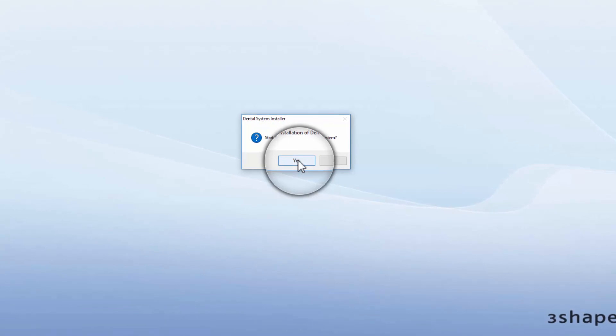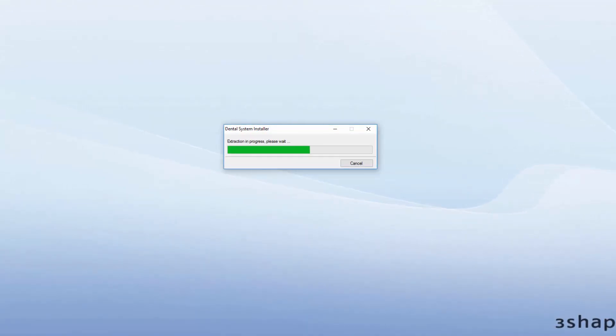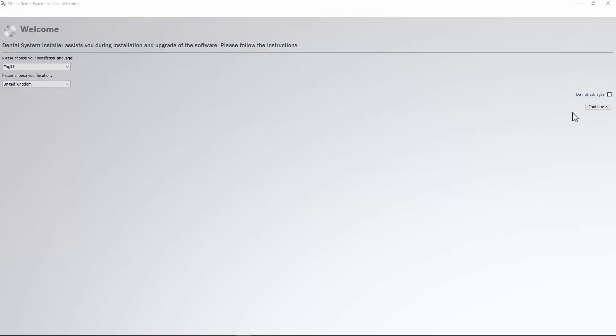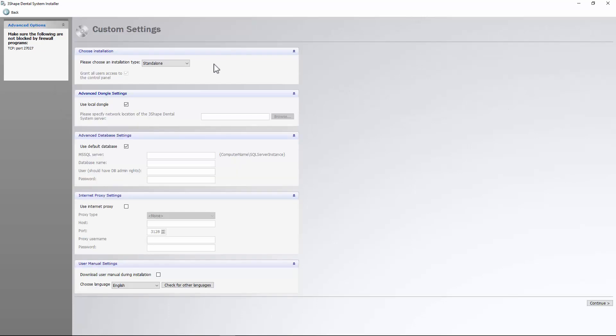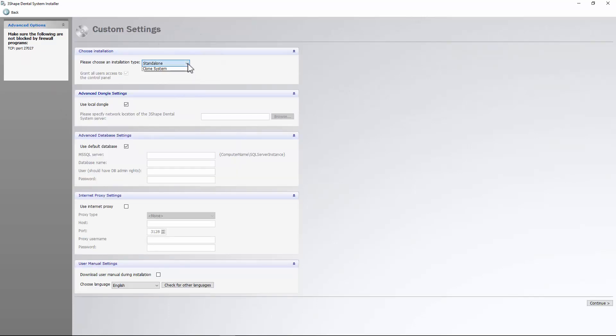Press Yes and wait for the files to extract. Choose the installation language and click Continue. Then select Custom Installation and choose Server Install from the drop-down menu and specify the necessary settings.